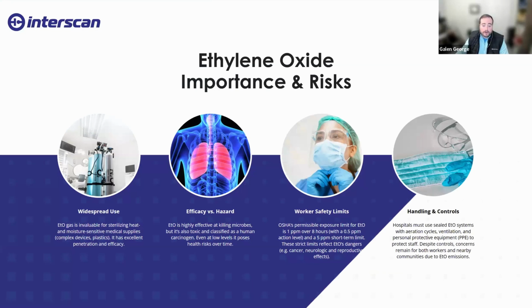So let's talk more about ethylene oxide. It's often considered the gold standard for sterilization of sensitive equipment. Its ability to penetrate packaging and device crevices is unmatched, and that's why things like catheters, stents, and electronics often rely on ethylene oxide sterilization. But this benefit comes with serious risks. Ethylene oxide is toxic, flammable, and a proven carcinogen.